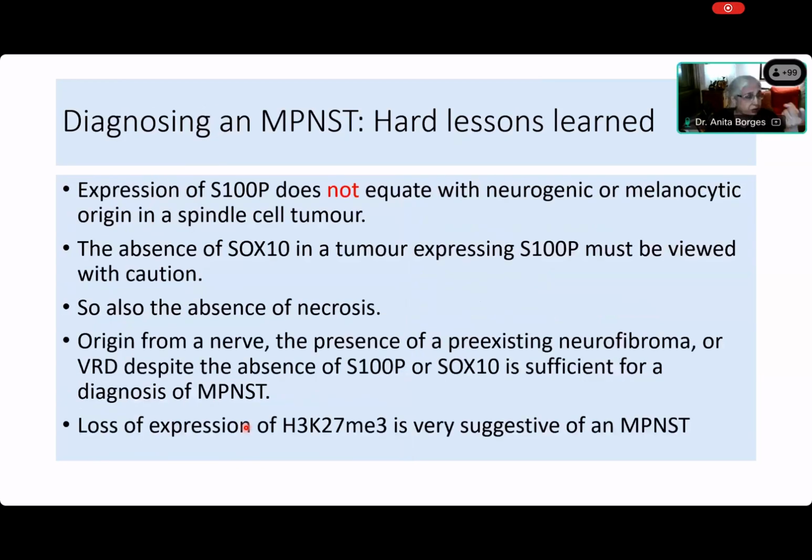The lesson about MPNST is that expression of S100 protein does not equate with either neurogenic or melanocytic origin in a spindle cell tumor. We saw a case just now which had S100 protein and CD34, and it was not either a neurogenic or a melanocytic tumor. Absence of SOX10 in a tumor expressing S100 protein must be viewed with caution. So also the absence of necrosis.